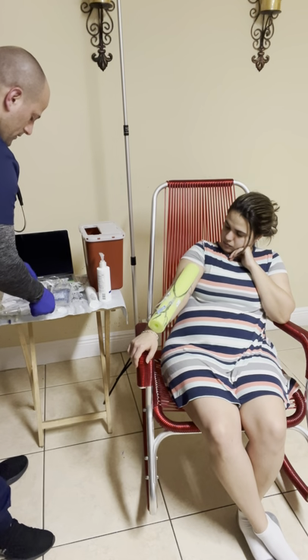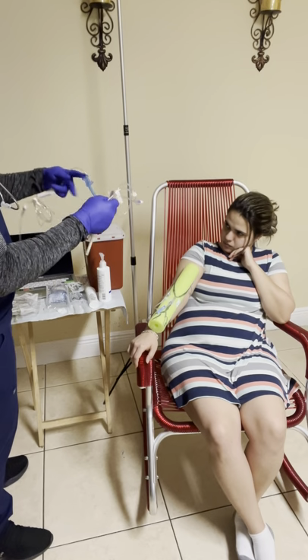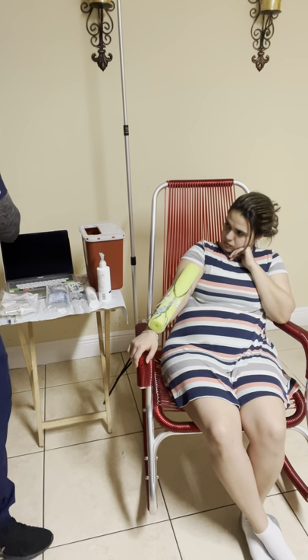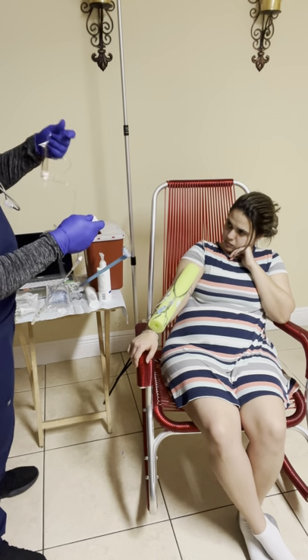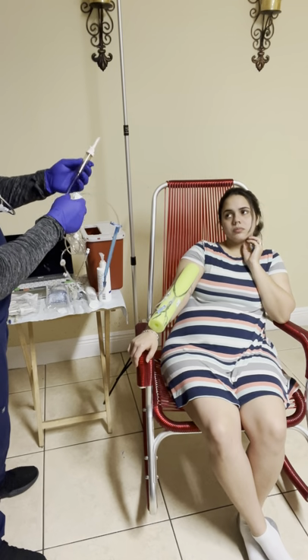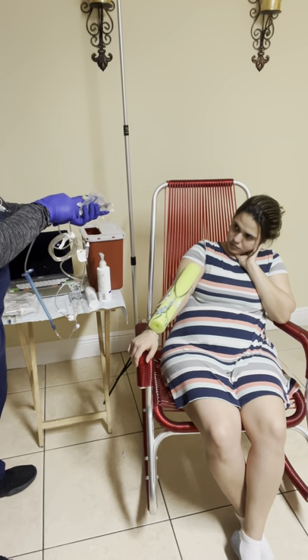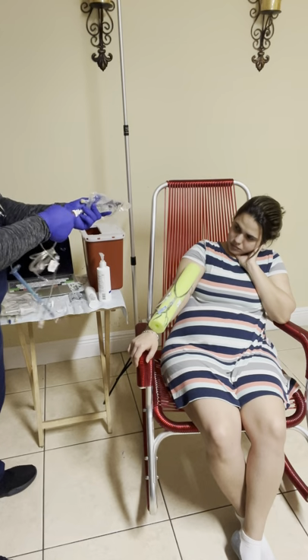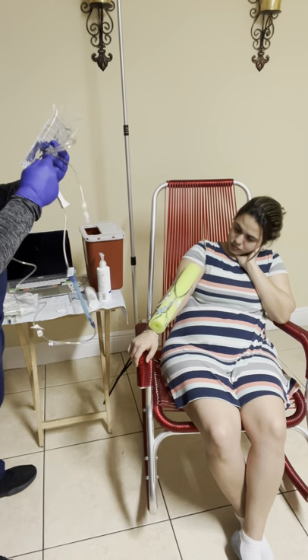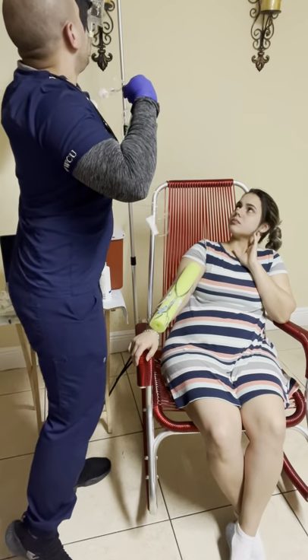Now I'm going to prepare the IV line. I'm going to clamp it with the roller. Now I'm going to spike the IV bag properly. I'm going to put the IV bag in the holster.